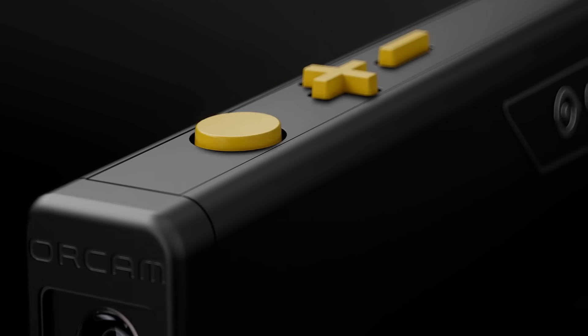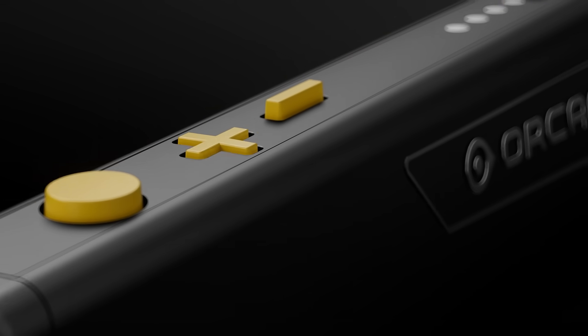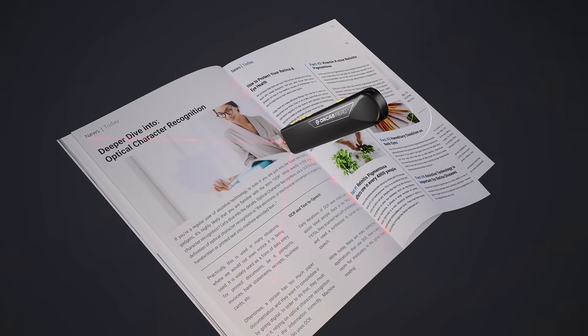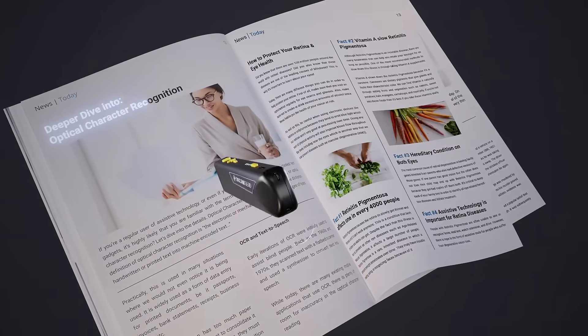To hear the device read any printed or digital text out loud, use the device's distinct yellow buttons to activate a targeting laser that lets you point and click at the text of your choice.